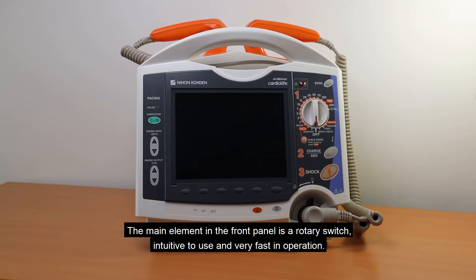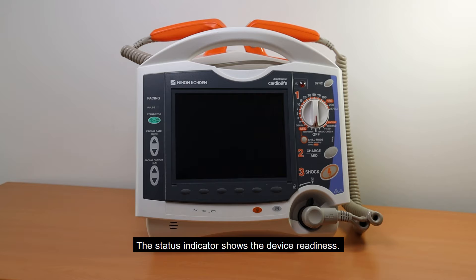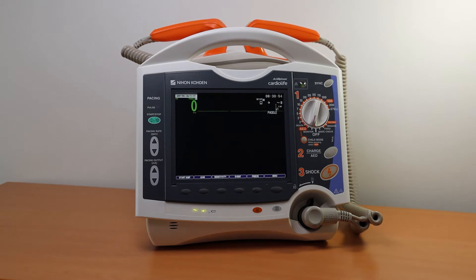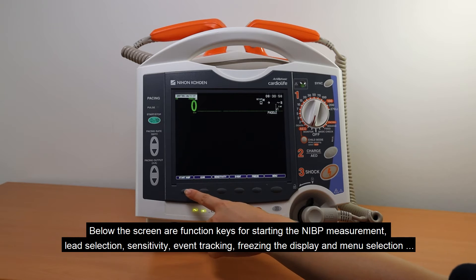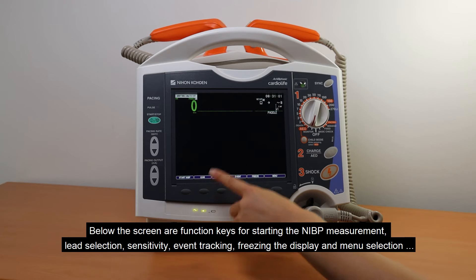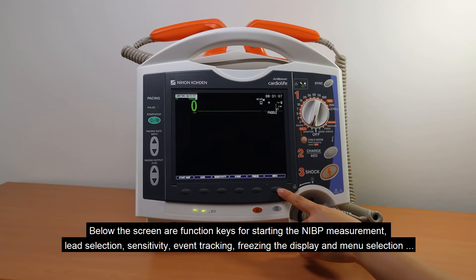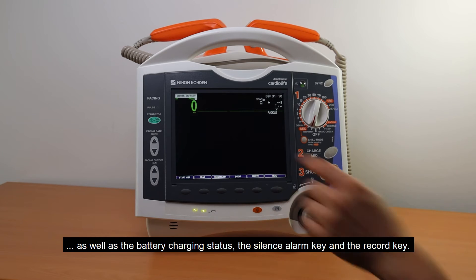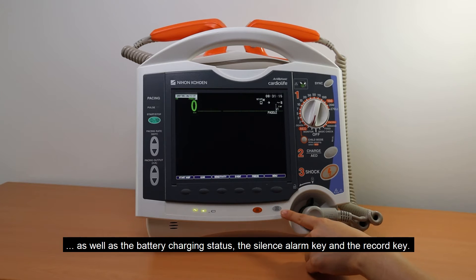The main element on the front panel is a rotary switch, intuitive to use and very fast in operation. The status indicator shows the device readiness. Below the screen are function keys for starting the NIBP measurement, lead selection, sensitivity, event tracking, freezing the display, and menu selection, as well as the battery charging status, the silence alarm key, and the record key.